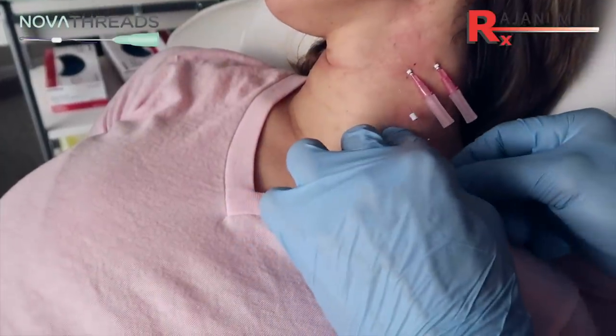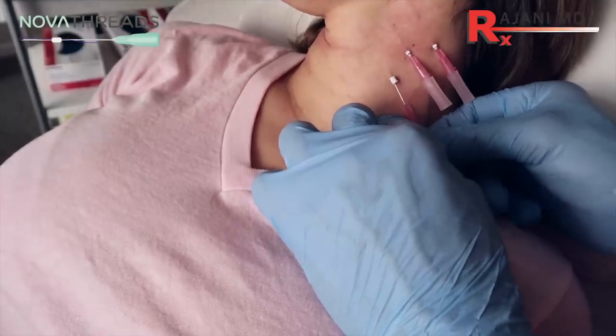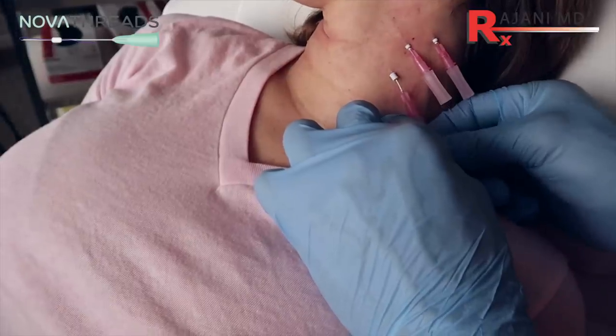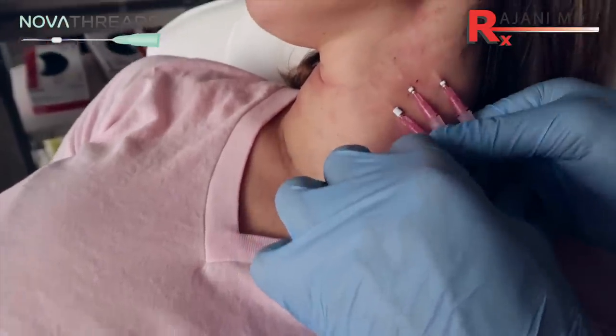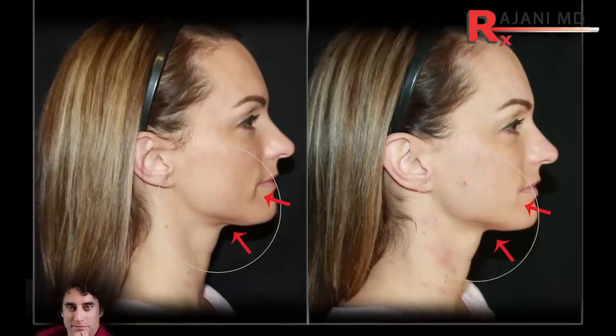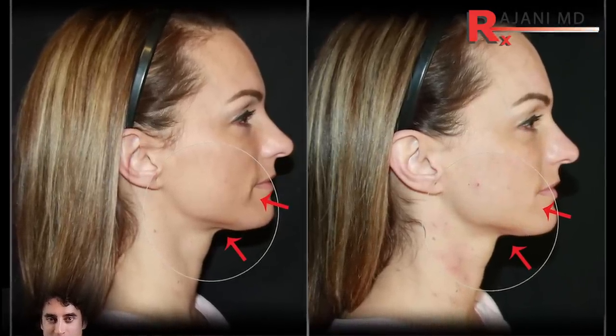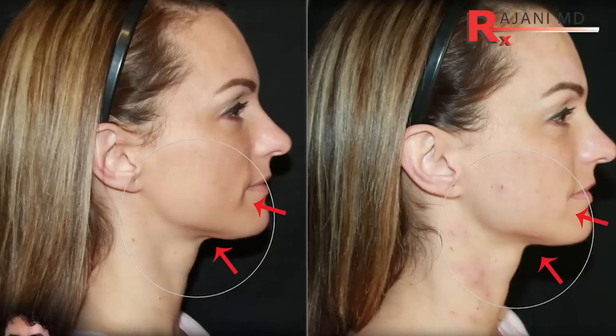We've got our last one here. This will mesh, it will create collagen, and it will help prevent the lines and take care of the ones that are in there. Structure and support — so there's a great combination. Combination therapy is all the craze; it's how you get the best, most natural result. Join us on this YouTube channel, leave your comments below, also on Facebook and Instagram for continued helpful tips. Keep your skin and body beautiful, healthy, and vibrant.